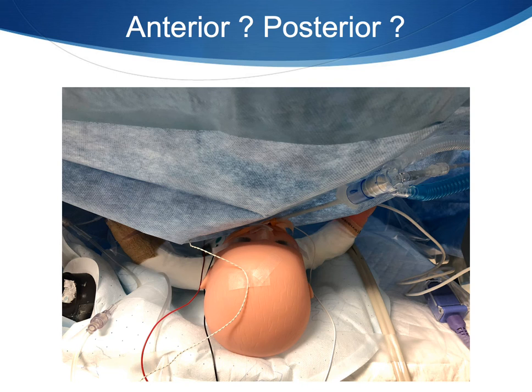What can happen with these soft, pliable endotracheal tubes in these small pediatric populations is they can flip around and turn. And what that means is if it turns, the Murphy's eye is no longer where it's supposed to be, and now it's facing the left side. And why this is important, we're going to show you in a few slides, is because with any little millimeter of movement in these small pediatric populations, that endotracheal tube can become endobronchial, or it can actually extubate your patient.